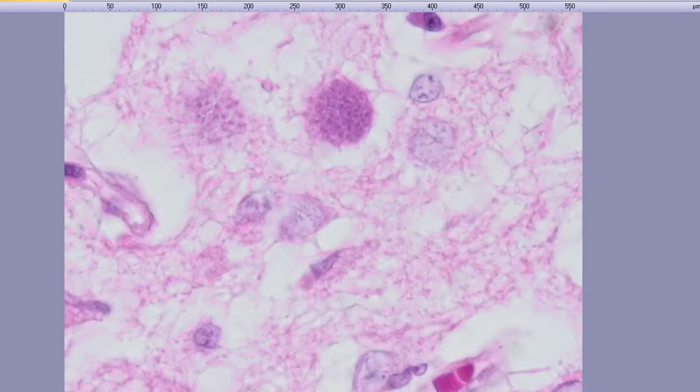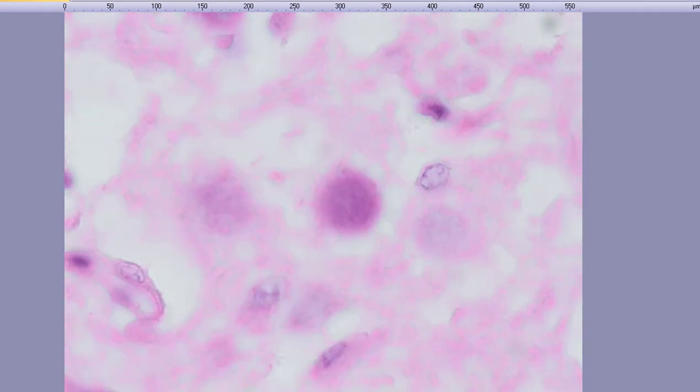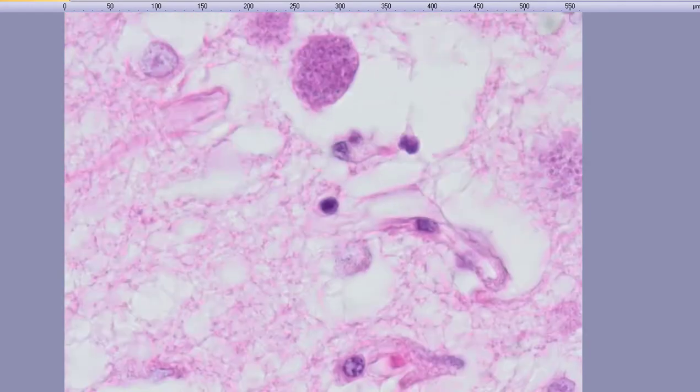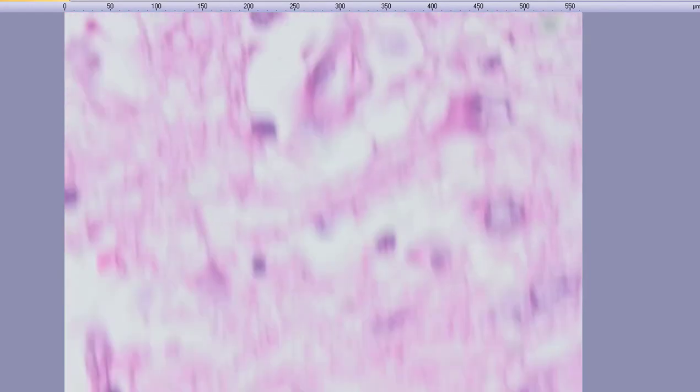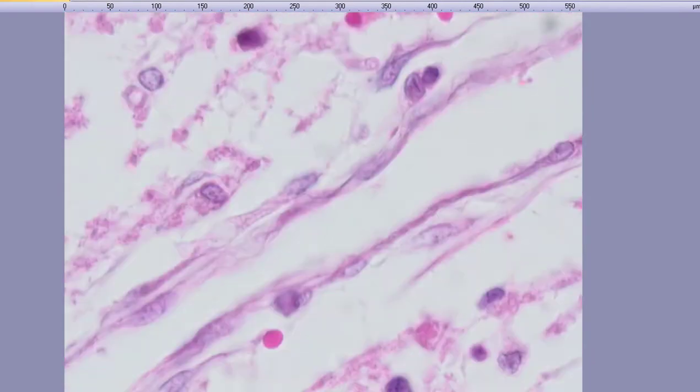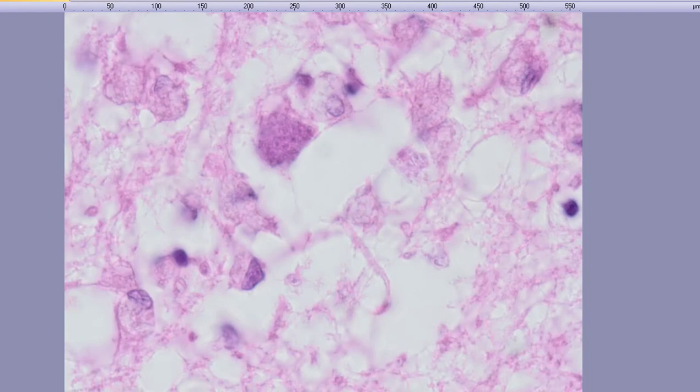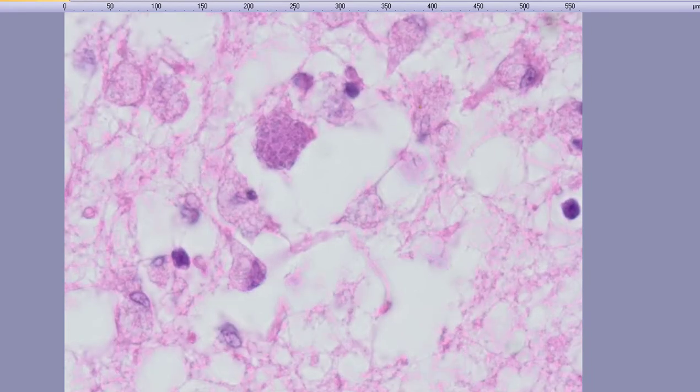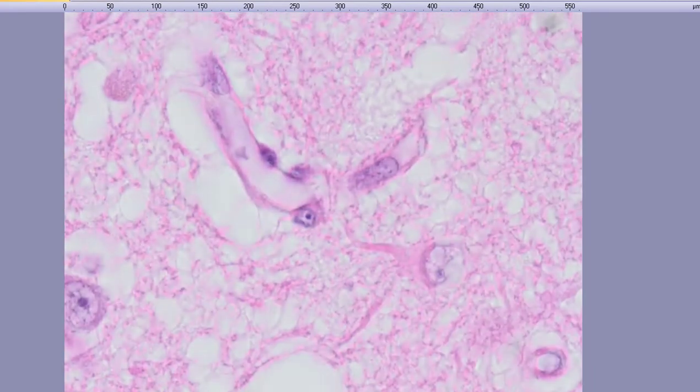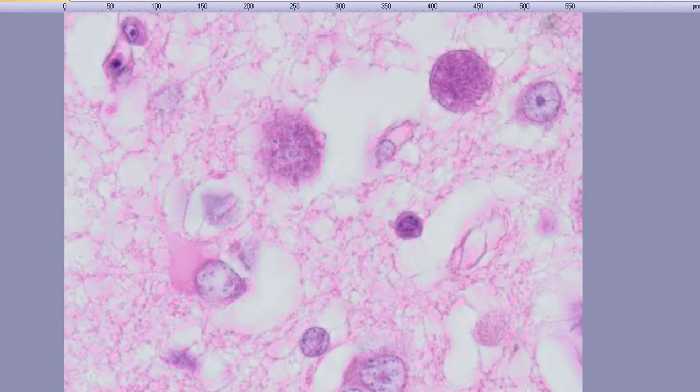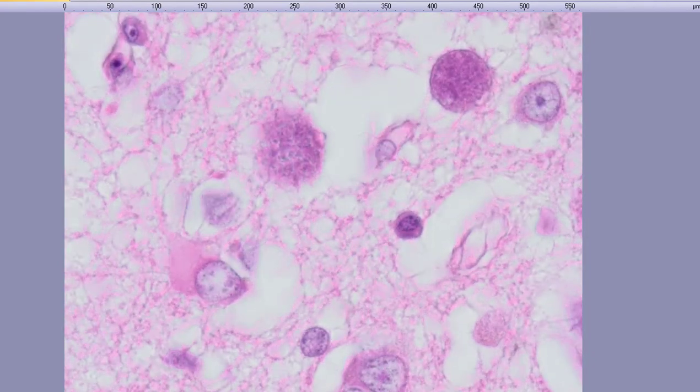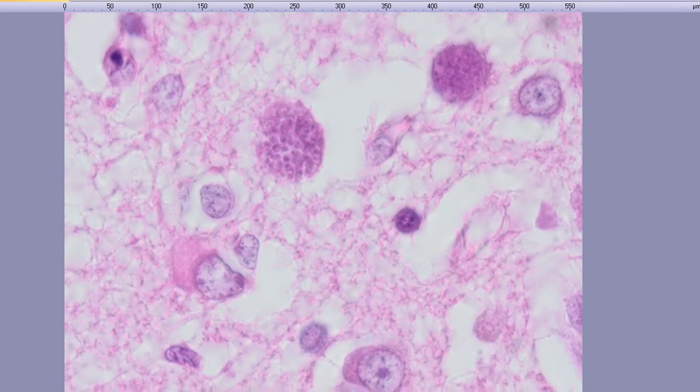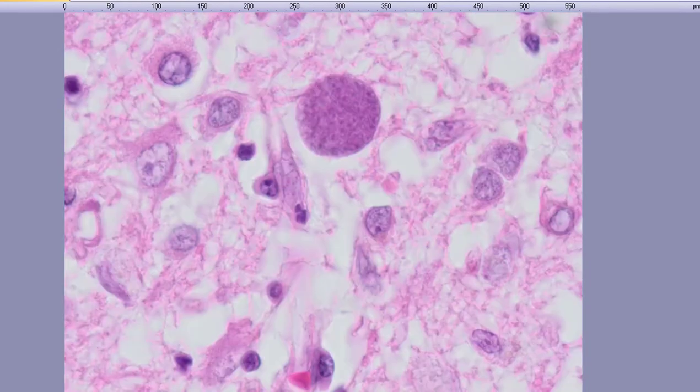So we can take a closer look at these cysts. See, there they are. Cysts filled with bradyzoites, the Toxoplasma gondii parasite. Here's another one.